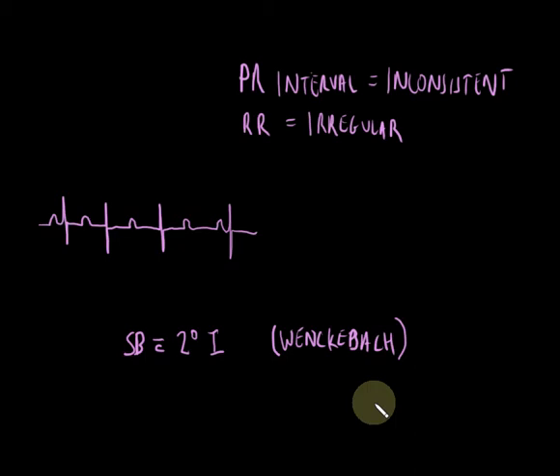So if the person has Wenckebach, what they're talking about is they've got this weird pattern of what's happening. Now, the cross check for this that is relatively important, and I want you to catch, take a look at this for a second. I might have you pause the video here. Take a look at this and see, do you see any pattern to that PR interval? Go ahead and pause, and then we'll come back and talk about it.